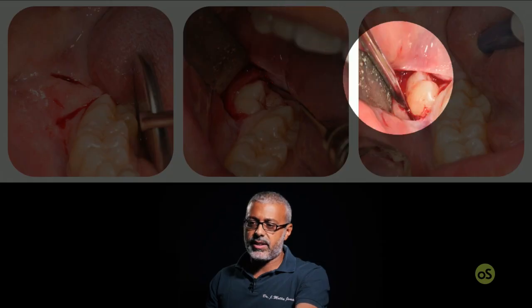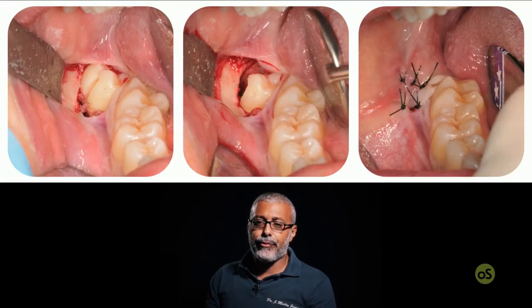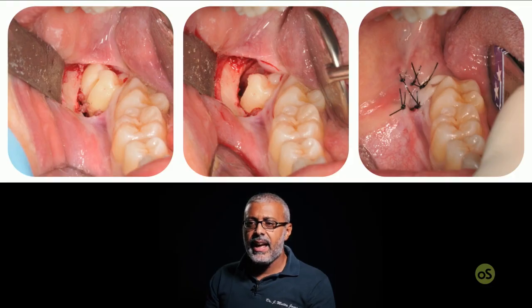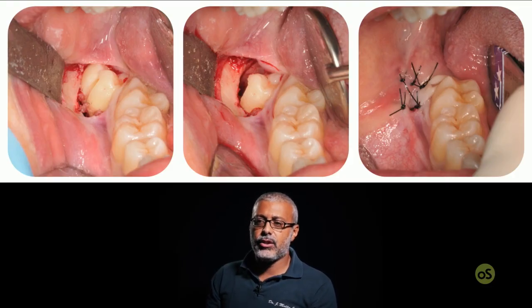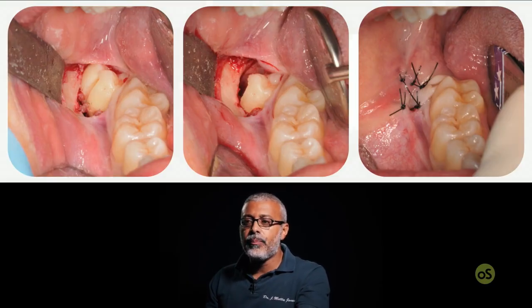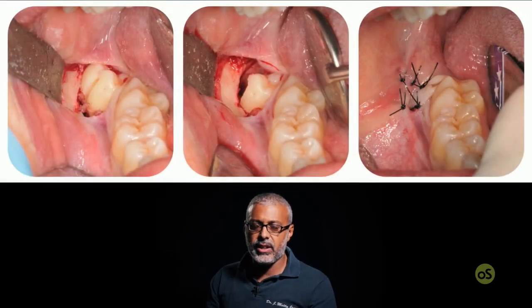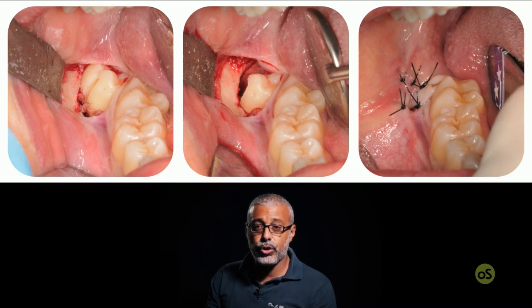Here we start the luxation procedures, and then we perform the tooth sectioning, and then the closure of the wound once we extract the tooth. And in this case, I would say that making so many knots of the suture is not so easy to handle. So I prefer the triangular single flap I have just showed you.